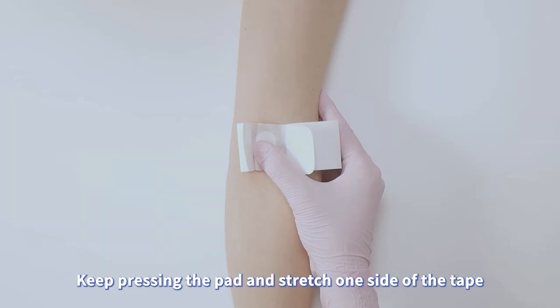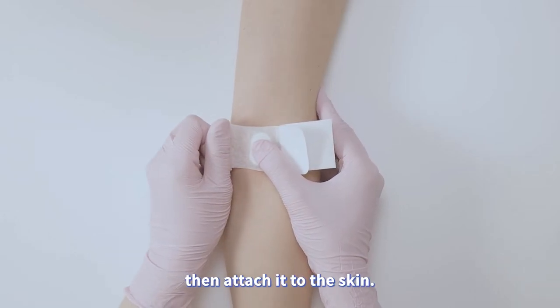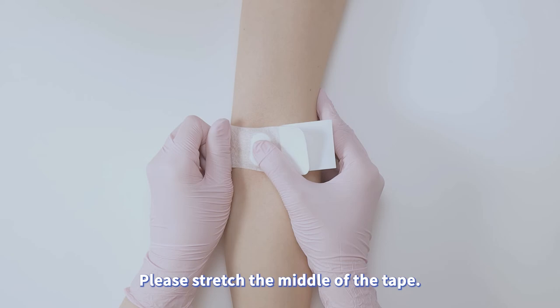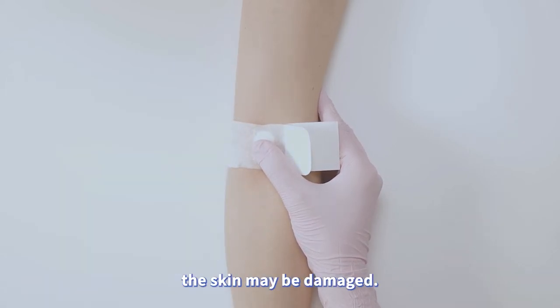Keep pressing the pad and stretch one side of the tape for 1 cm, about thumb width, then attach it to the skin. Please stretch the middle of the tape. If you stretch the end of the tape, the skin may be damaged.